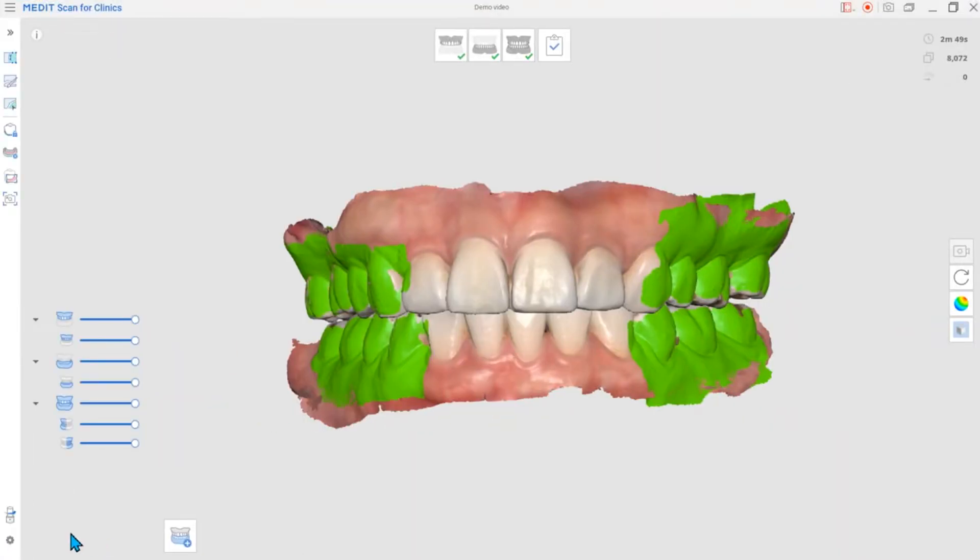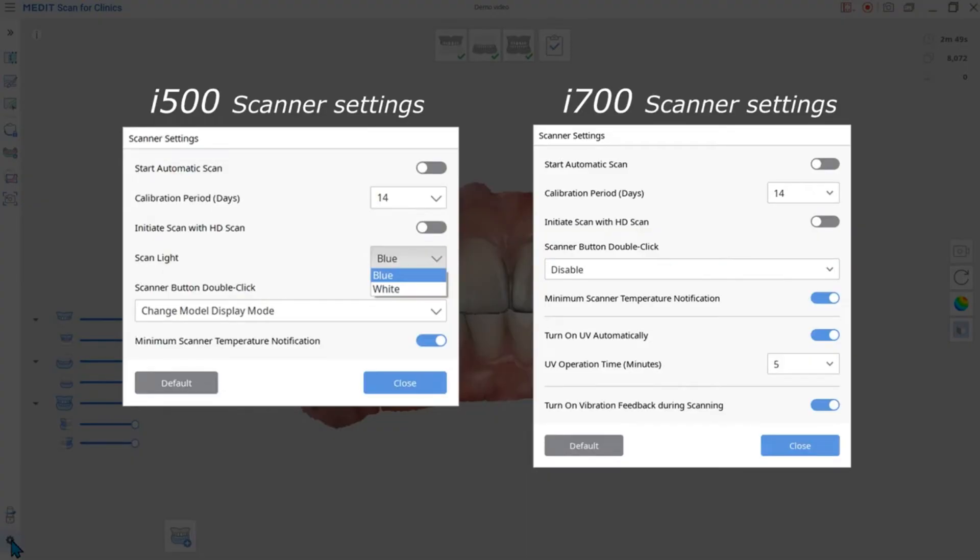The next one is the scanner settings. Depending on which scanner you connect, the settings will change. As you can see, I700 and I500 have different setting options.